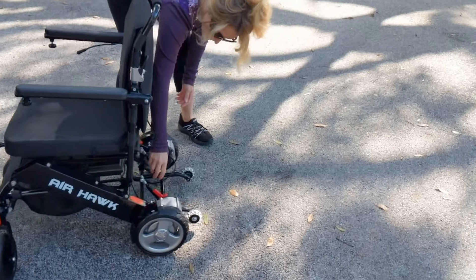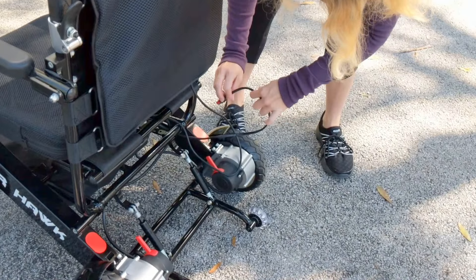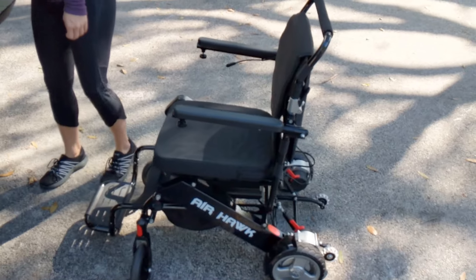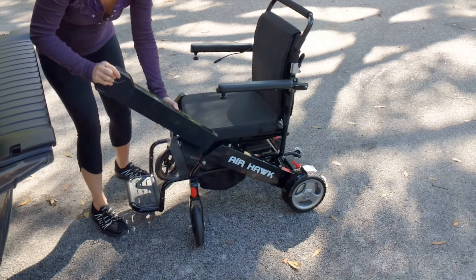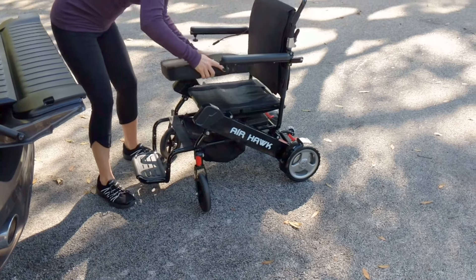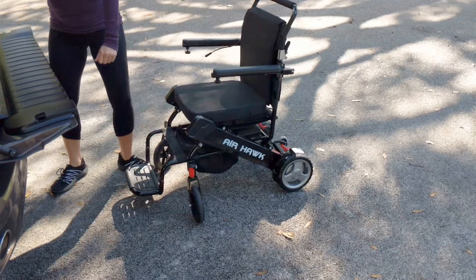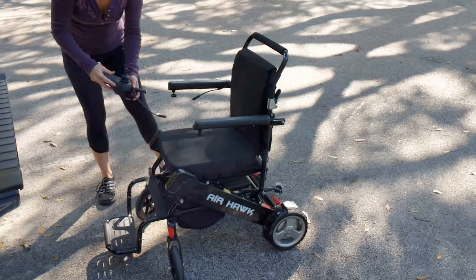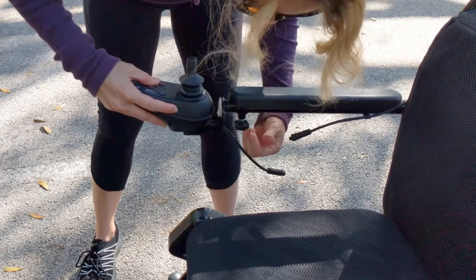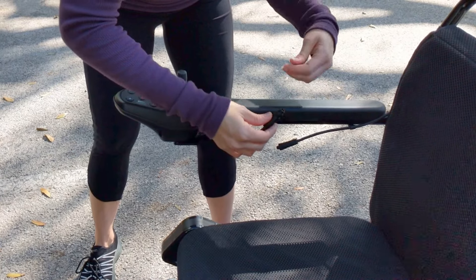It only requires one battery to operate, and you can see how easy, how fast, how simple it is to get that chair fully functional and operational. Just to make certain that we're not going to ever run out of batteries, we're going to put the free extra battery that comes with the chair right into the other arm, and as a final step we're going to attach the controller.